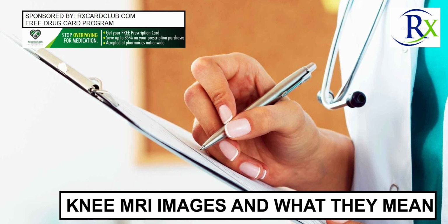In cases of tendinitis such as that seen with jumper's knee, an MRI will usually reveal progressive knee injury in the form of scarring, inflammation, and malformations of the tendon itself.